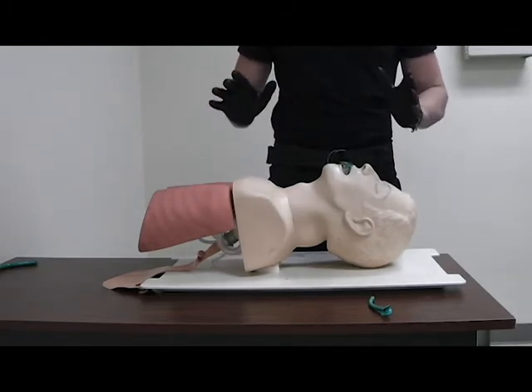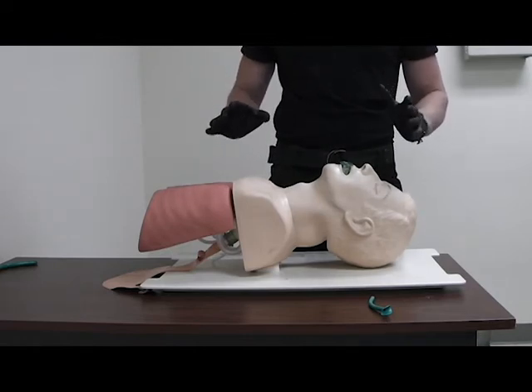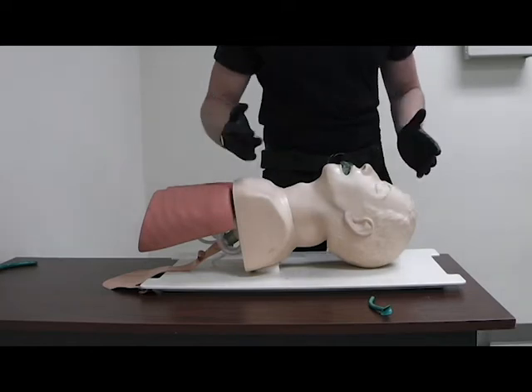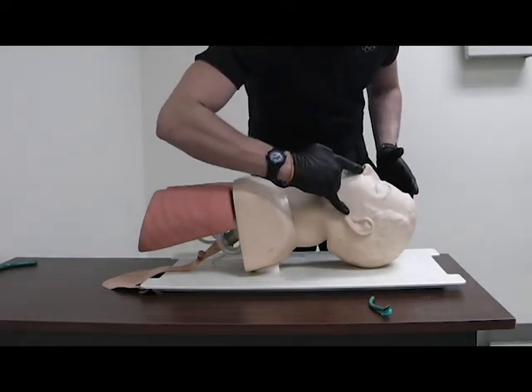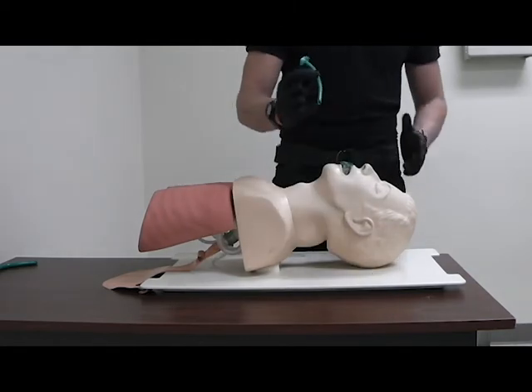For the NPA, you don't want them to have any facial trauma before inserting it into their nose. You size it from the corner of their nare to their earlobe — this size is appropriately sized.